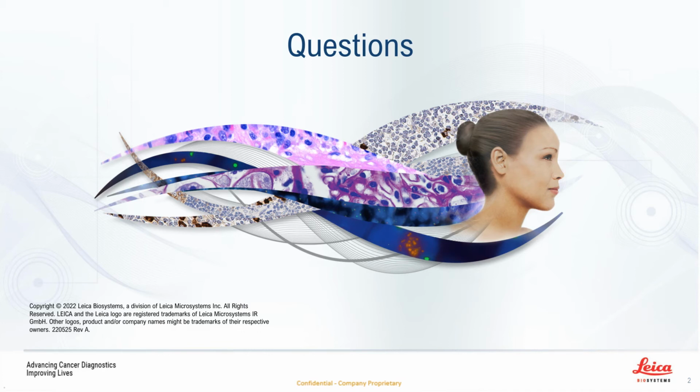Next question. What about fixed sections or cytology preparations? How can these be handled? Yeah, and another great question, and one that's quite similar in a lot of ways. I think if your sections are inherently thick and you don't have the option to cut thinner sections because of what you're looking at in your tissue or your sample, then you are going to have to consider Z stacking to be able to capture all of those focal planes and to maximize what you get out of that tissue or out of that slide.